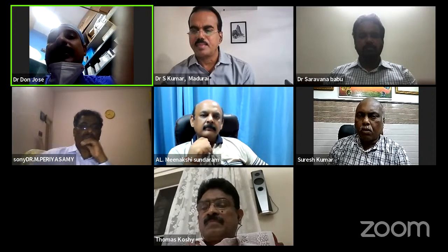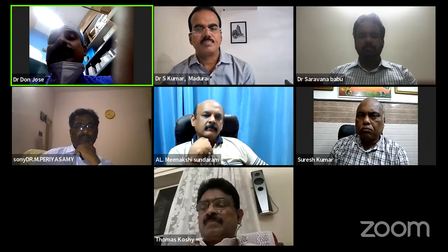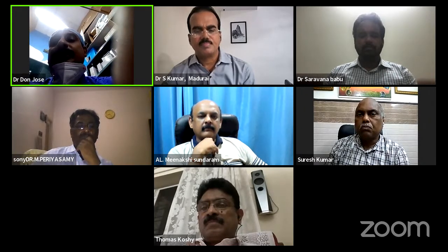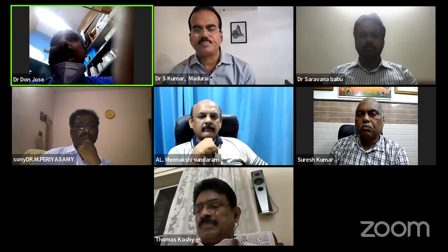So after the induction, sir, we record the baseline and keep following the trend, and any change in the baseline of more than 20%, especially at the time of clamping, we watch for. If there is a fall in the baseline, then it is the time to increase the pressure, sir, for the contralateral perfusion. Or else, some of the surgeons prefer the shunt also, sir.